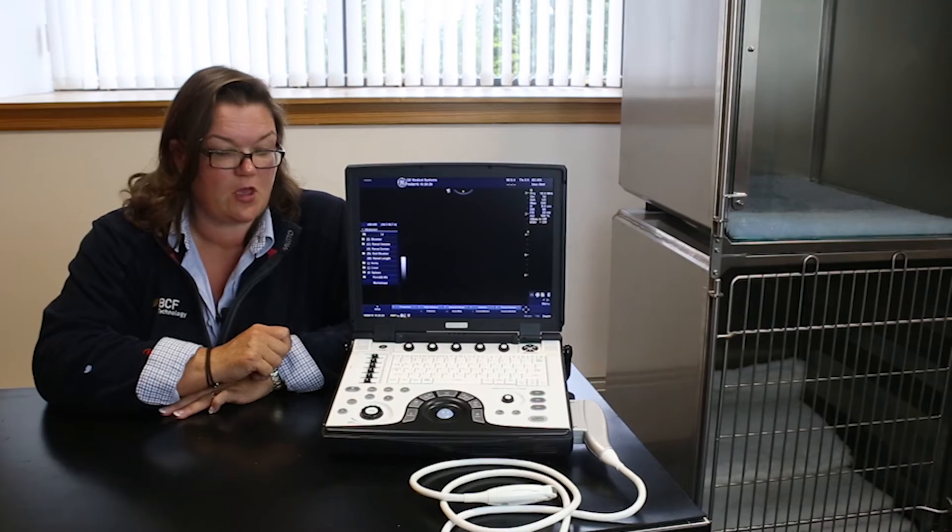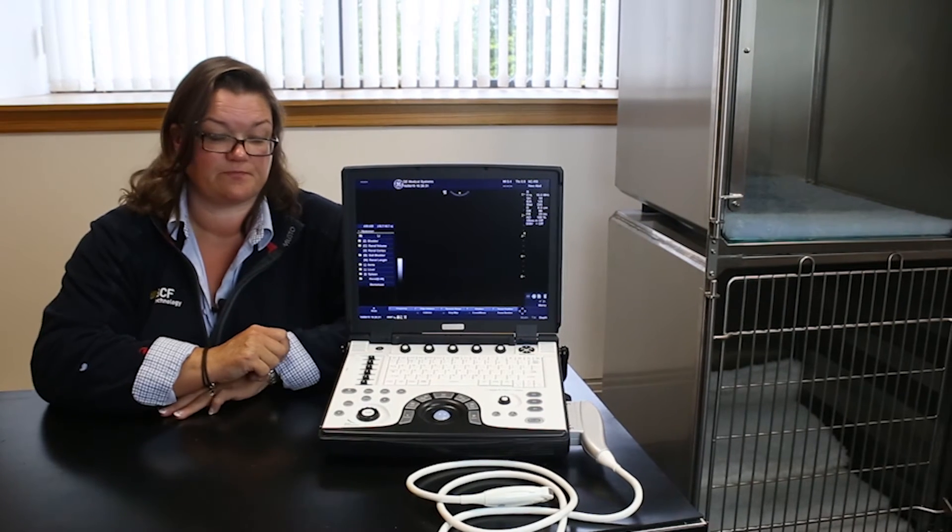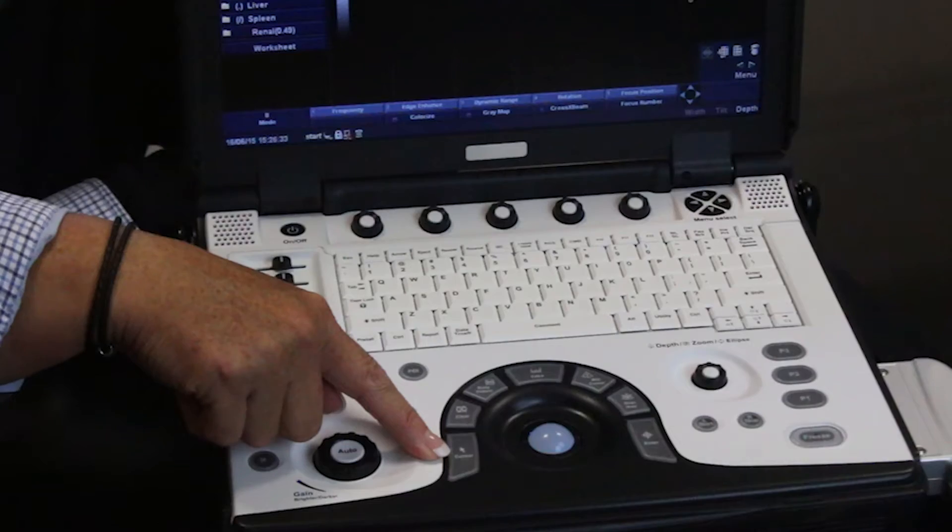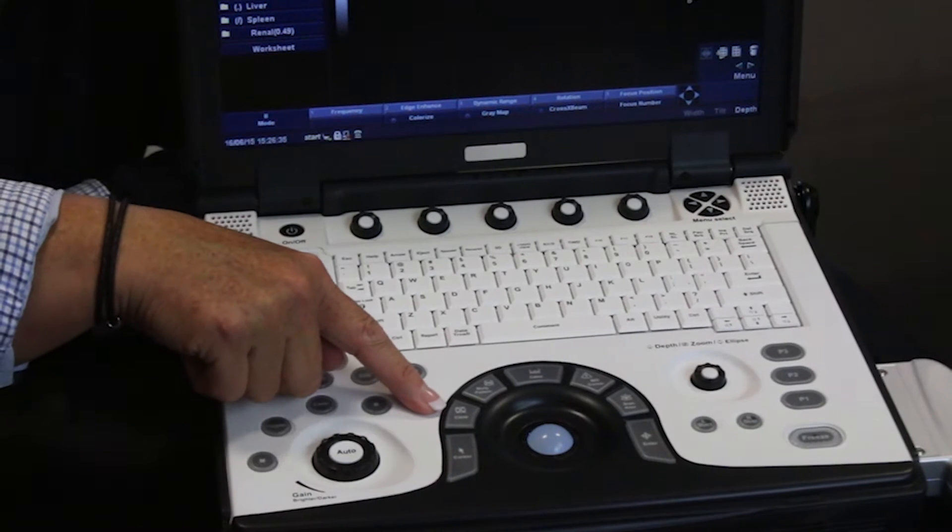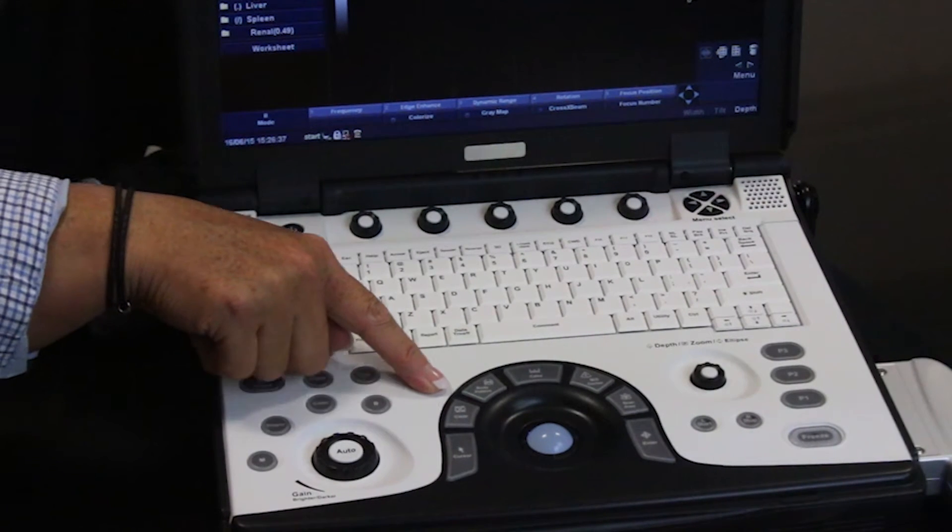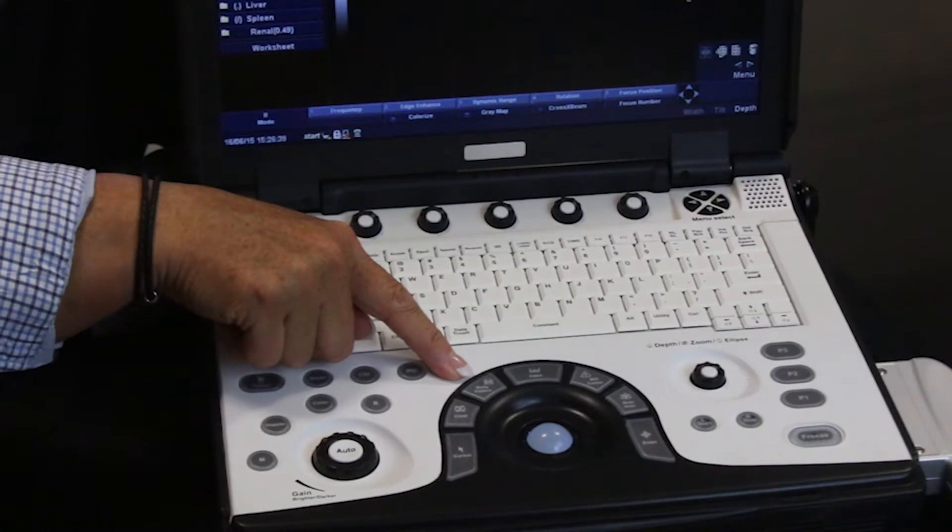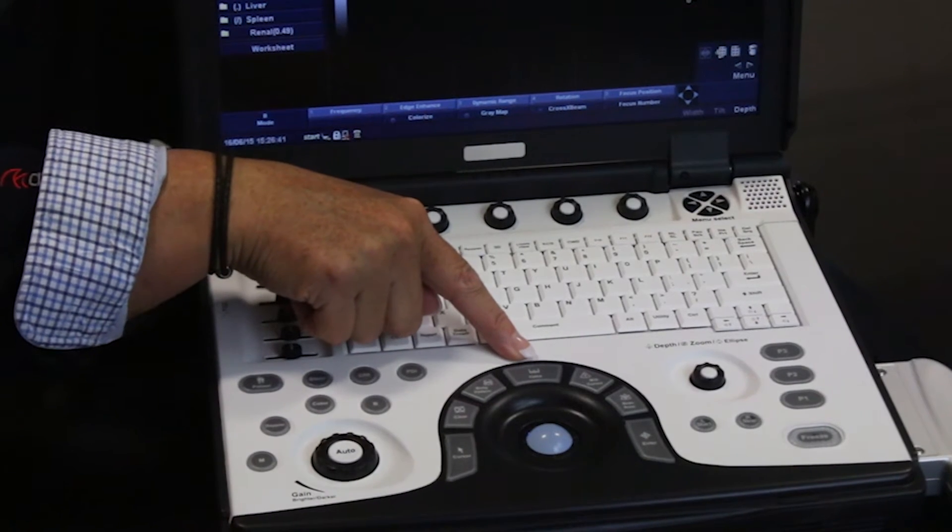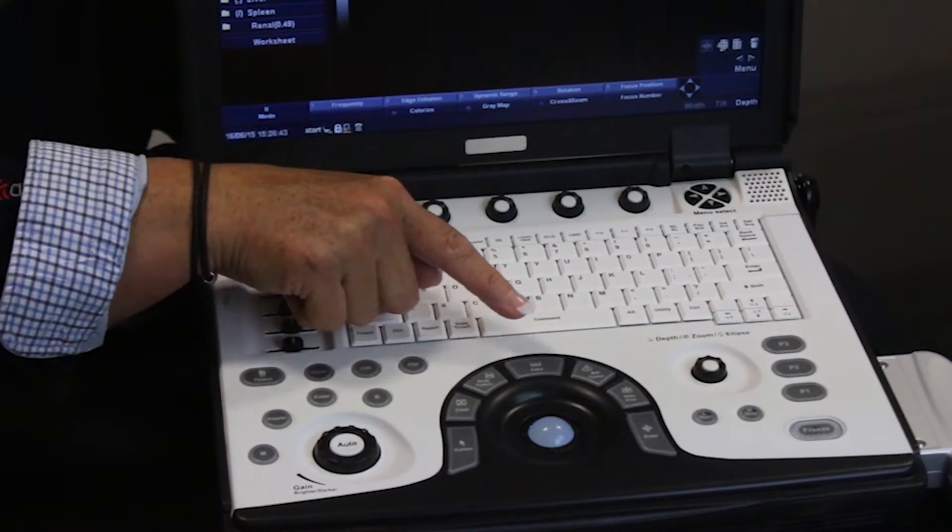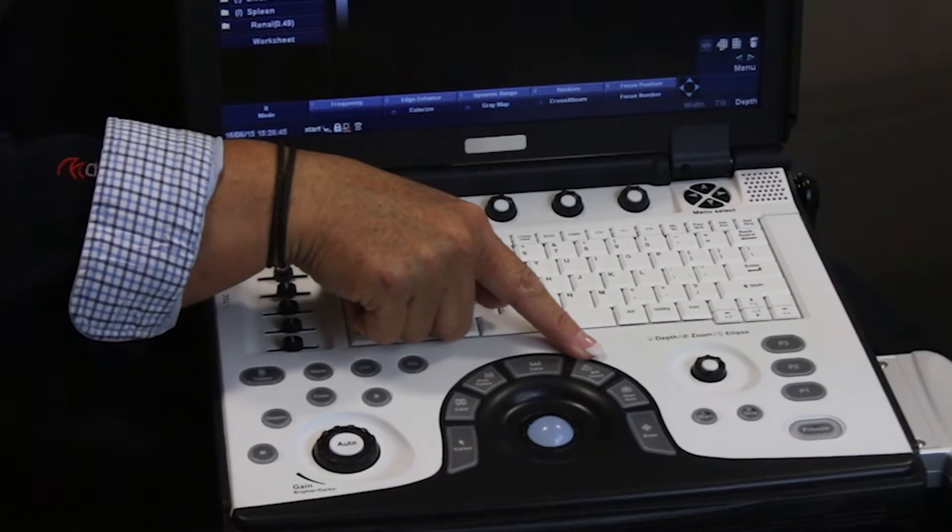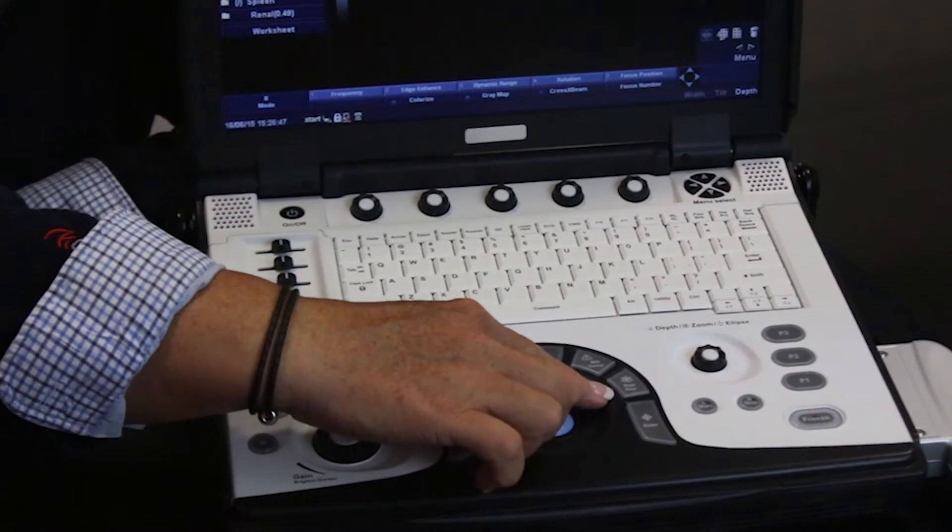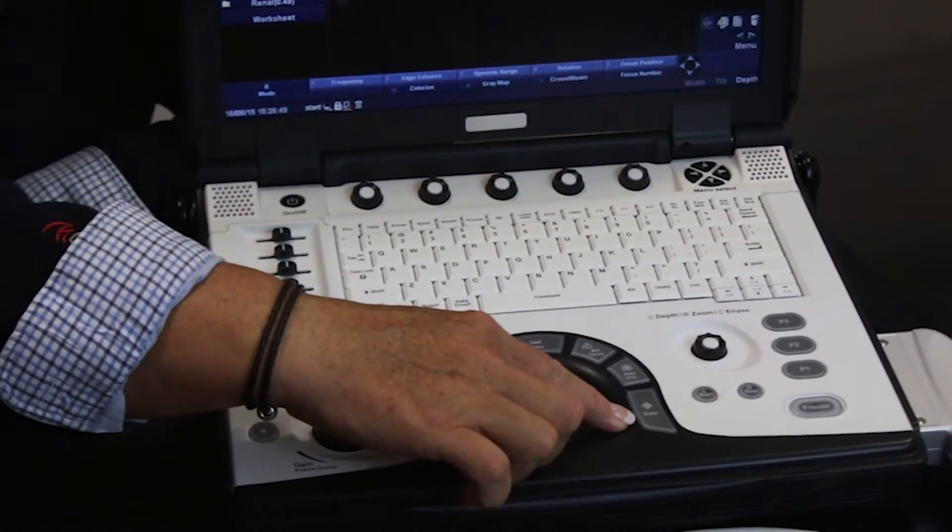On the trackball functions, we have cursor, a clear function, body patterns, calcs and measurements, MD cursor, scan area and enter.